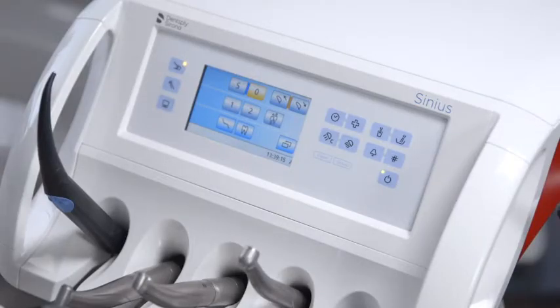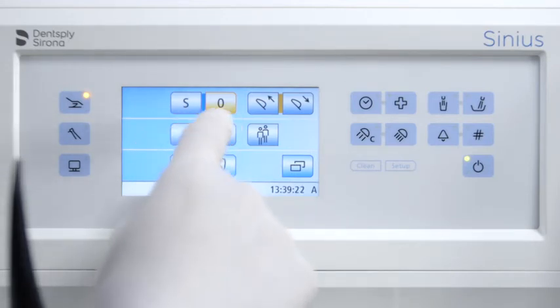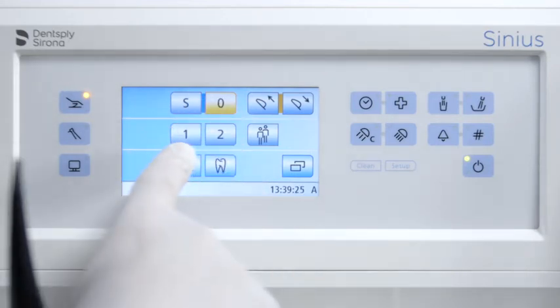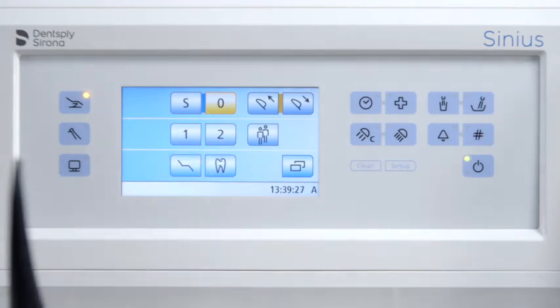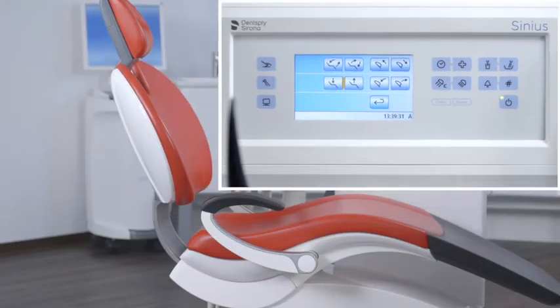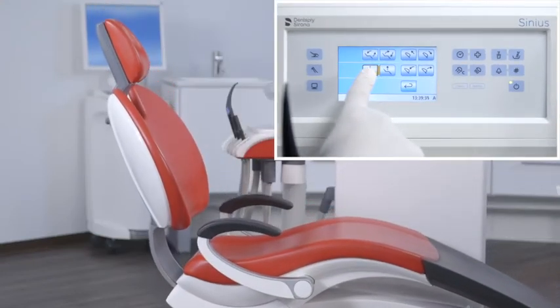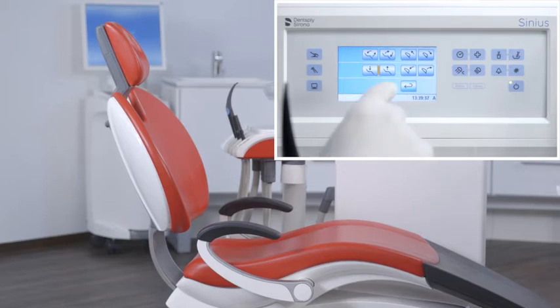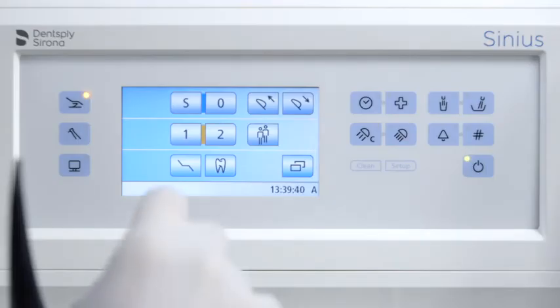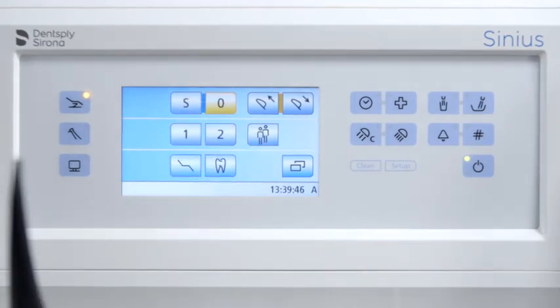The factory set chair programs — mouth rinsing position S, and entry and exit positions 0, 1, and 2 — can be reprogrammed individually for each of the six user profiles A to F. Set the chair position manually and press the desired program button for longer than two seconds. Your settings are now stored under the desired program button.